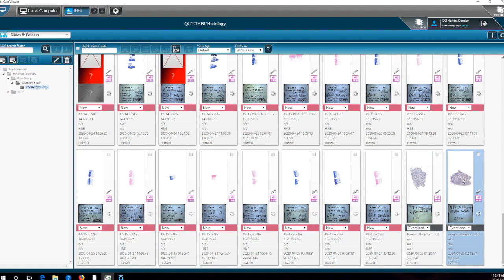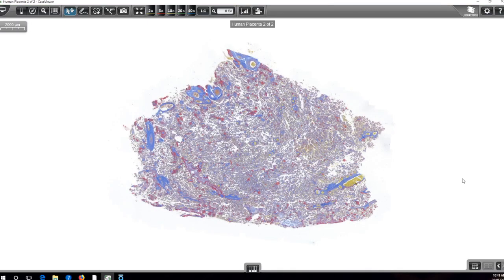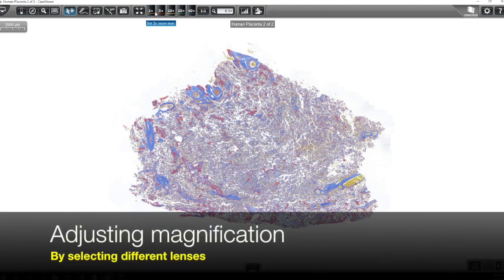If we scroll down here to the bottom, we've got a nicely stained control section of placenta. And so there's the full scanned image and it looks pretty good, but of course we would want to change the magnification.